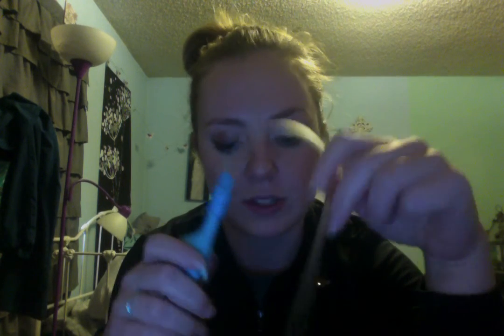So then 2 hours later, come back, and the next oral cares kit that I have is this little suction catheter. So again, grab this, suction out their mouth, and then I can trade this out for this one, where we can suction deeper down into their throat, of course keeping it clean. We don't want to be rubbing this all over the patient, so keeping this as clean and sterile as I can, and suctioning out the patient's mouth.